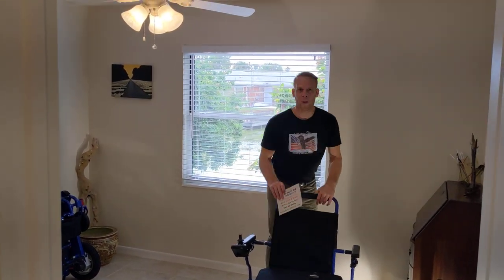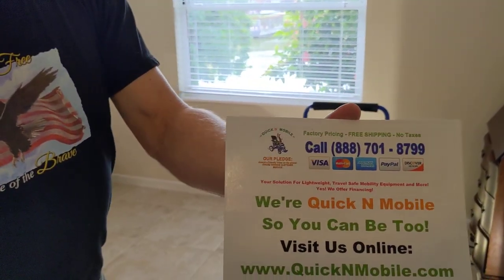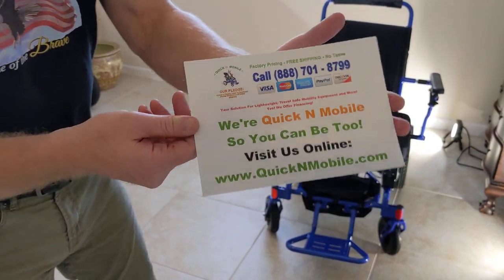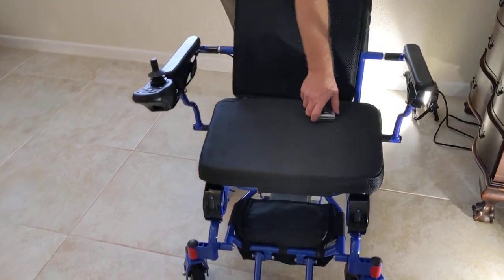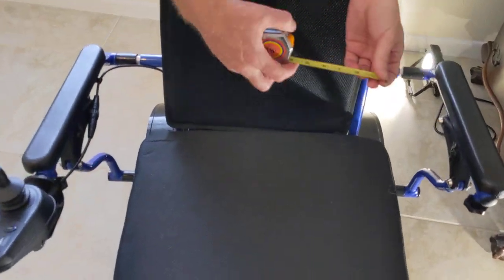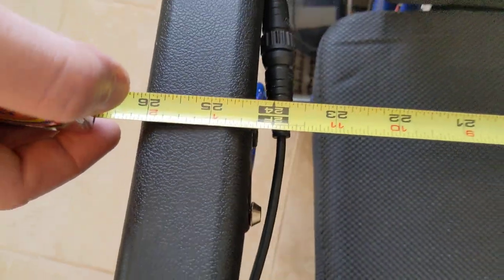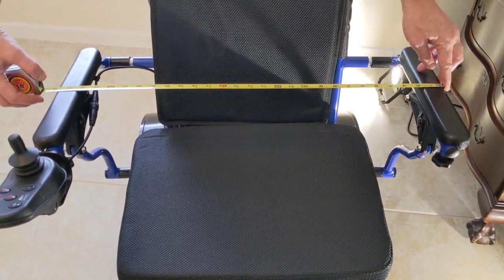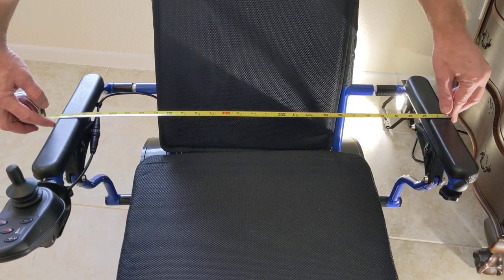Hello, this is Paul from QuickNMobile.com. Great opportunity to pause the video in case you want to find us online. We have an Electra 7 power folding wheelchair with the HD armrest extension kit, and we have 24 and a half inches of space in between the armrests and almost 28 inches of width on the outside of the chair.